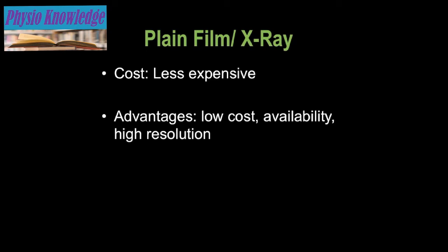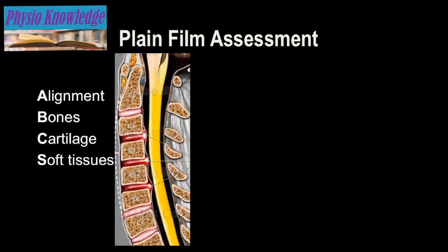And this is a very technical term, but in essence, for CT and MRI, we really have other types of resolution. In CT, we have contrast resolution. In MRI, for example, we would have greater temporal resolution and even contrast resolution in addition to tissue characterization. The plain films are really high resolution, and therefore it's a modality that can allow a lot of detail even when it's not very expensive and highly available.